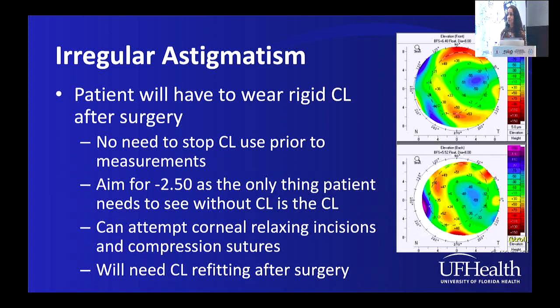So I don't tell them to stop their contact lens use before I do my measurements, because they're dependent on their contact lenses and they're very unhappy about stopping those even for a short while. So I will take them out, but then I tell them it might be off a little bit, but that much is probably not an issue because you're going to go back to contacts afterwards. We talked about this yesterday.